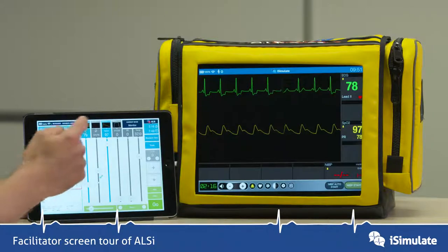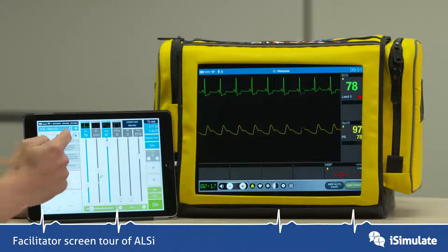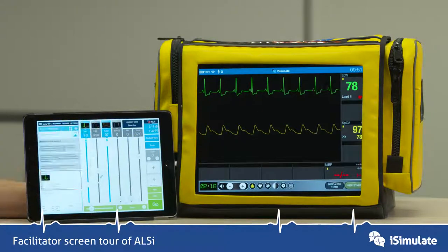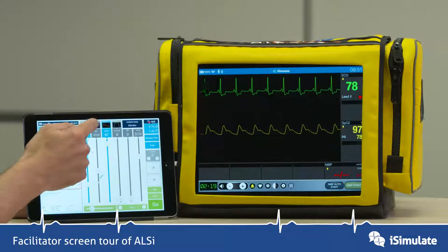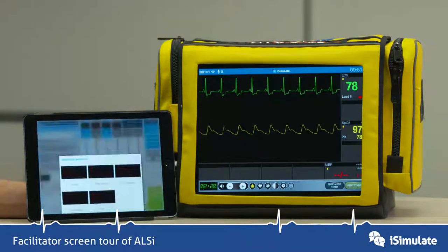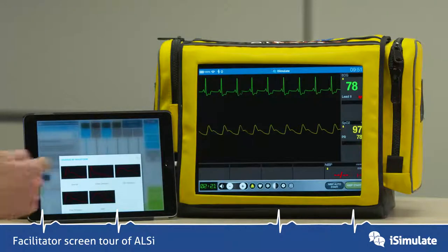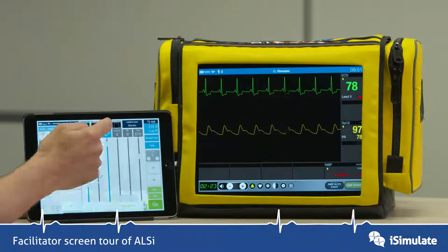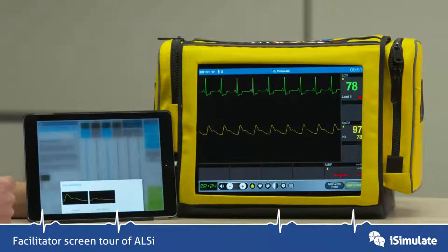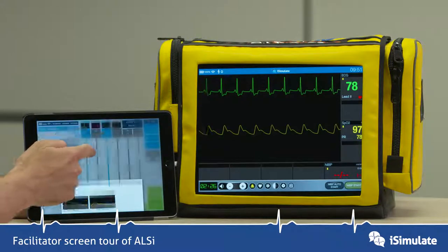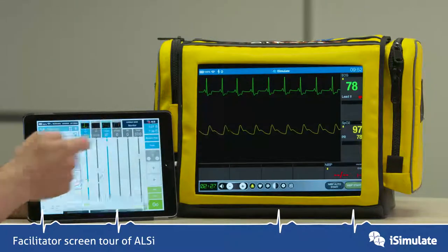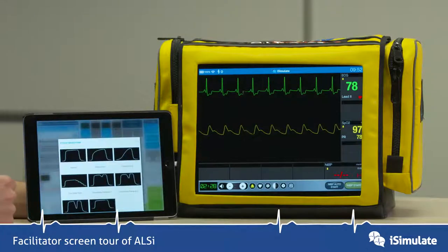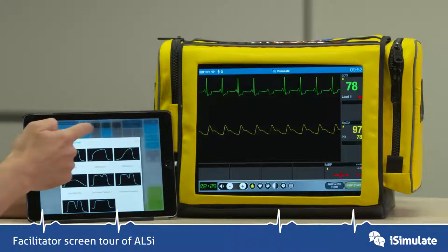That's the same for all of the boxes along the top. For the invasive blood pressure there are many different choices, and for pulse oximetry there are different ones, and the same for CO2 as well.